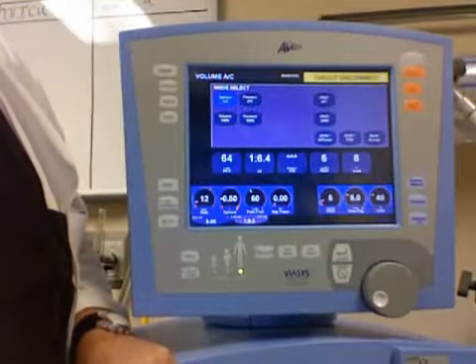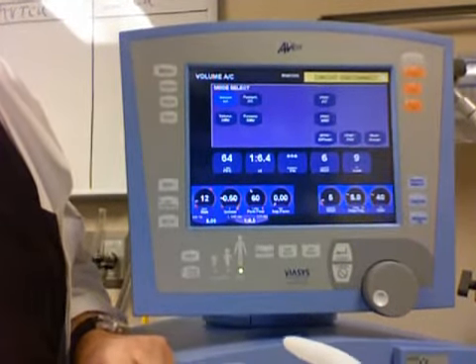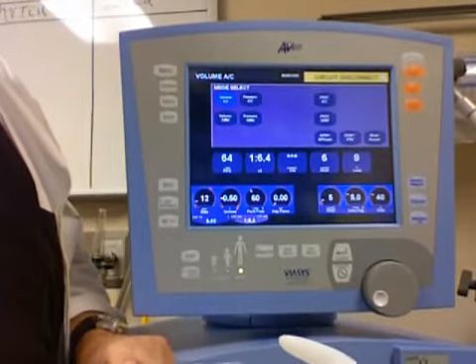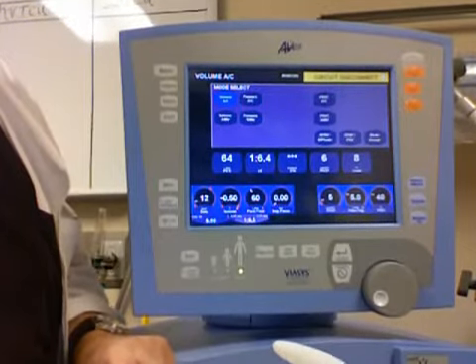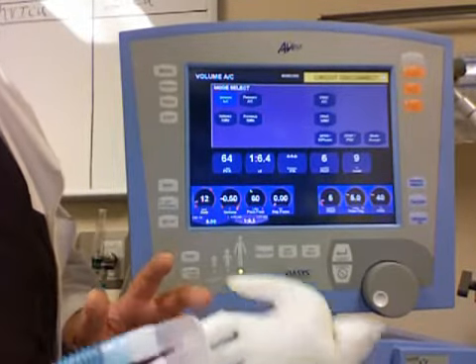And that's for ventilator breaths. If the ventilator is delivering a breath, there's two types of ending criteria that you can choose. Which one do you think we choose most often? Volume or pressure? Well, it depends on where you work and what hospital you're in.